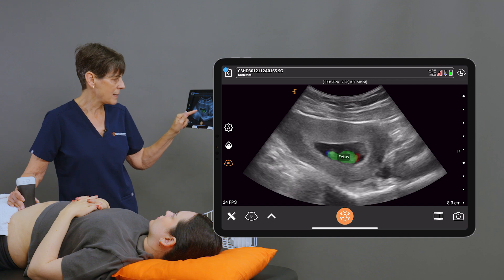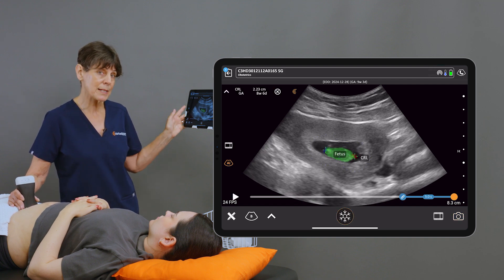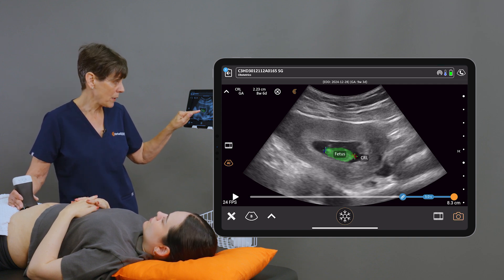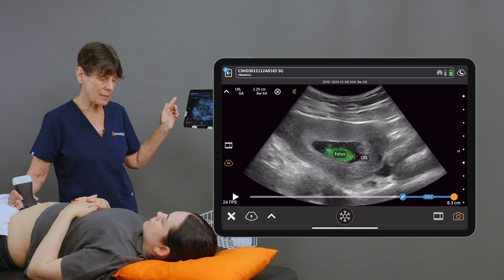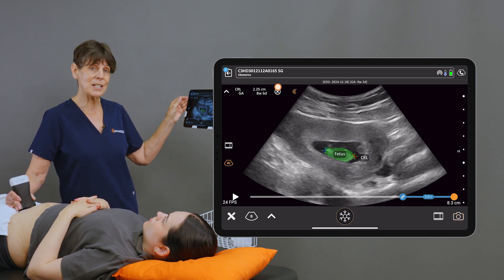When I see a nice red and a blue indicator, I'm going to freeze my image and you'll see calipers placed at the crown and the rump. I can adjust these if I don't like where the AI has placed them, but as you can see it is very accurate. It's giving us a gestational age of eight weeks and six days which corresponds very closely to the estimated due date.